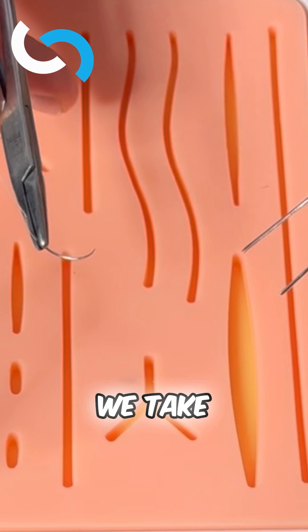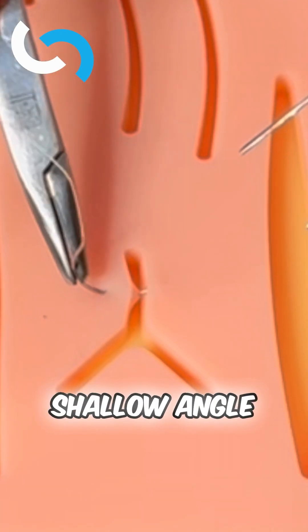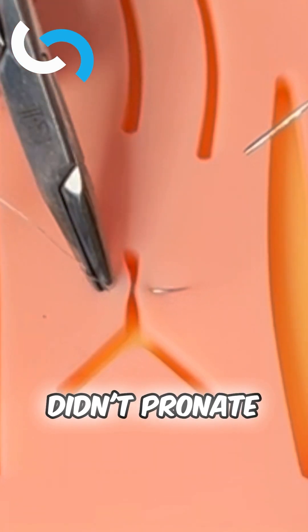Skiving is where we take a bite of tissue at less than 90 degrees and we take a shallow angle because we didn't pronate our wrist.